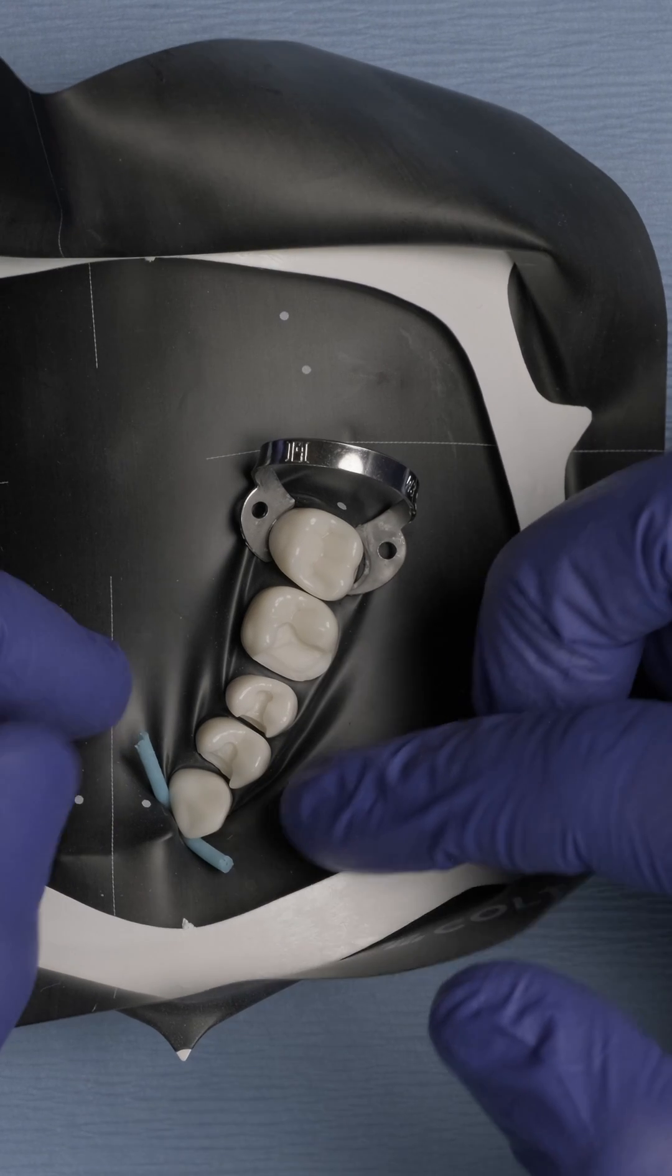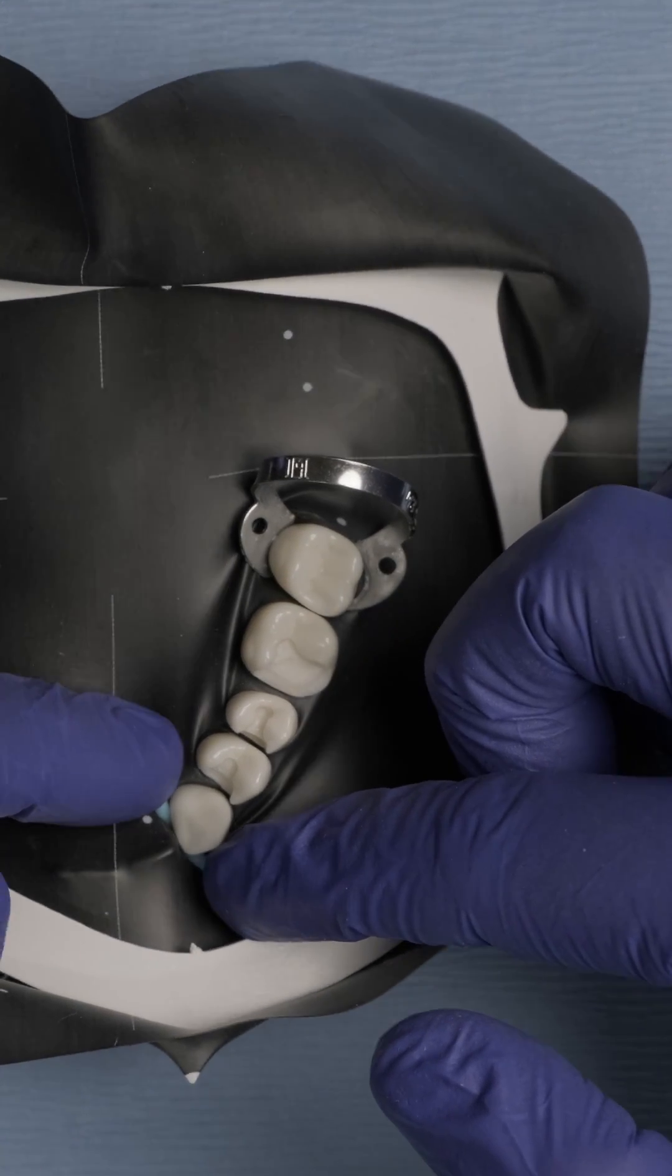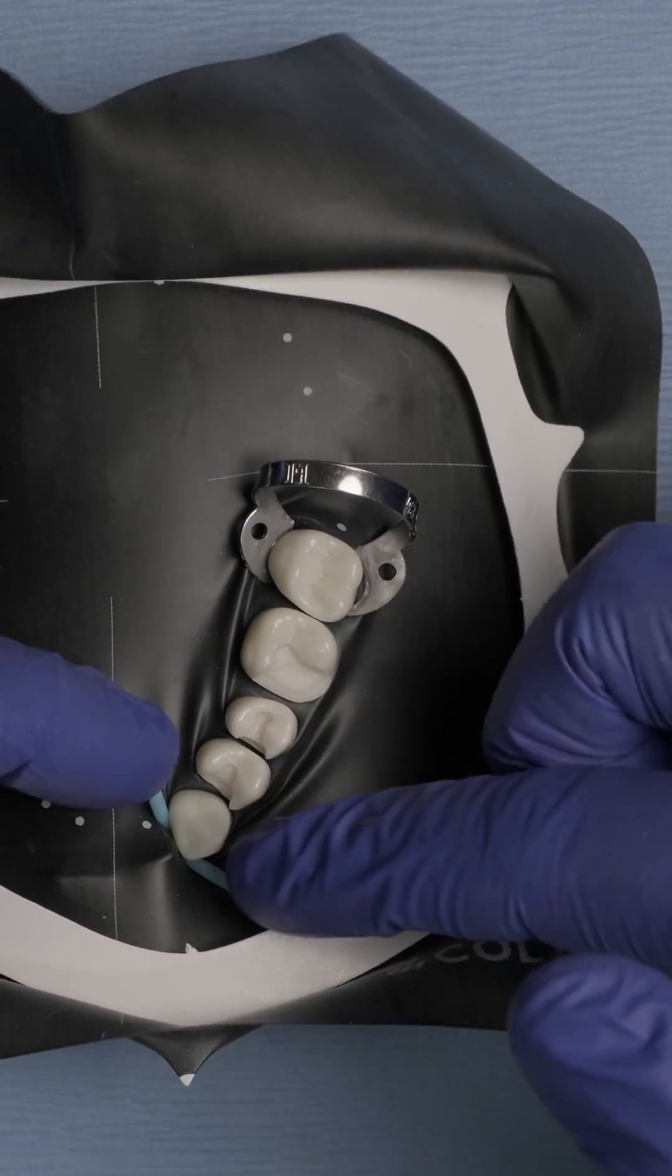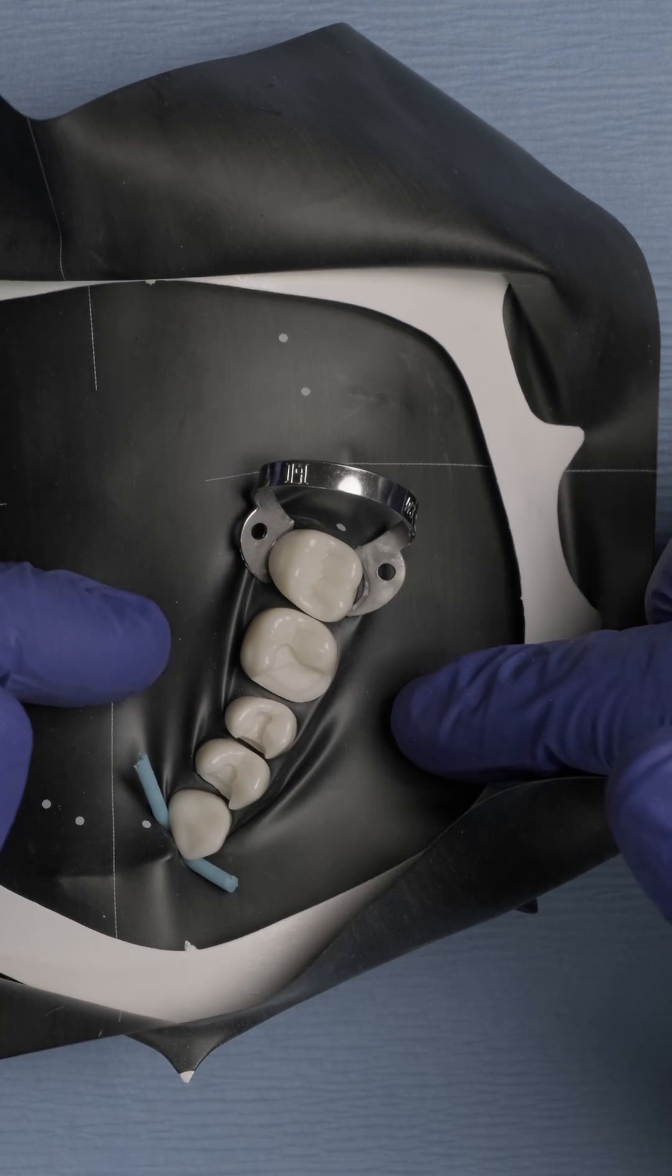This is going to keep the rubber dam in place. This and your retentive clamp. So always think about these two ways of securing or keeping your rubber dam in place.